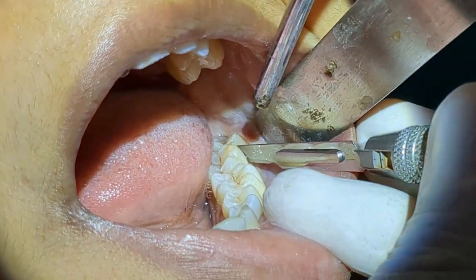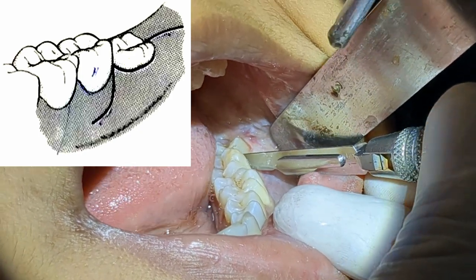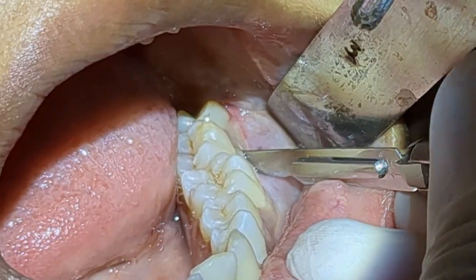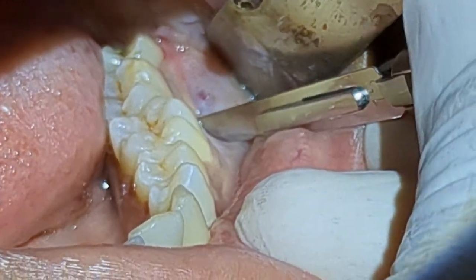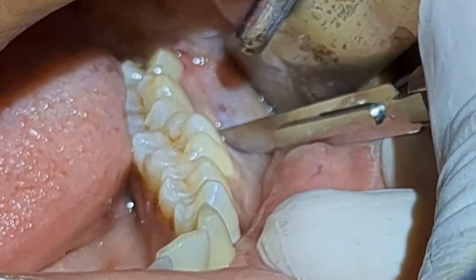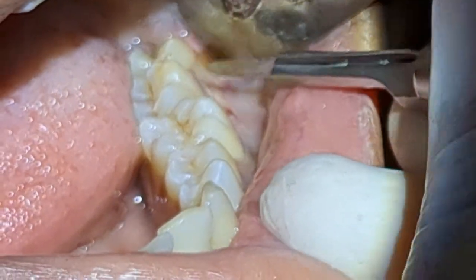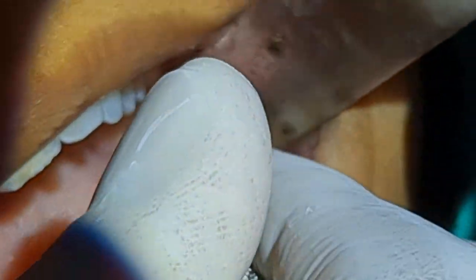I'll start from the disto-buccal line angle of tooth number seven — the second molar — at an angulation of 45 degrees. I'll go down into the sulcus. You can see I'm applying firm pressure over the bone. The idea is to cut through the soft tissue and the periosteum in one single stroke.